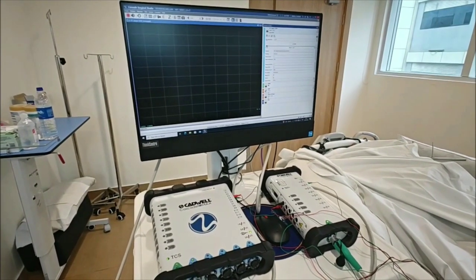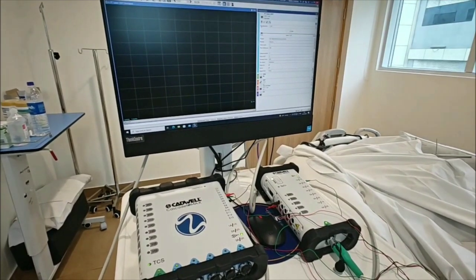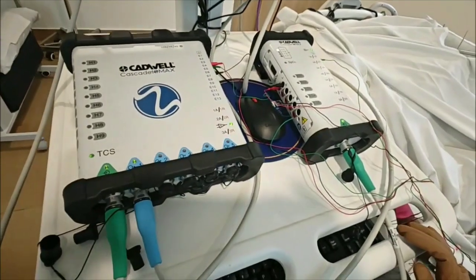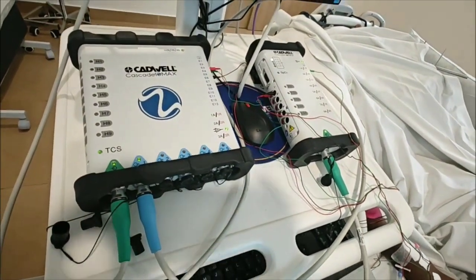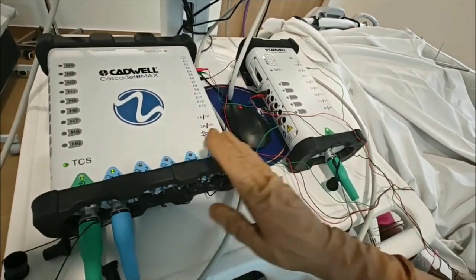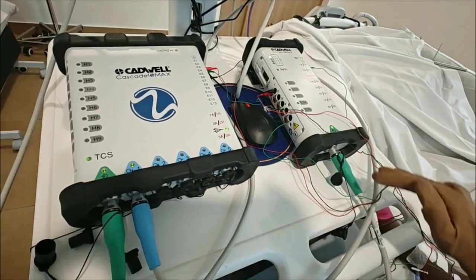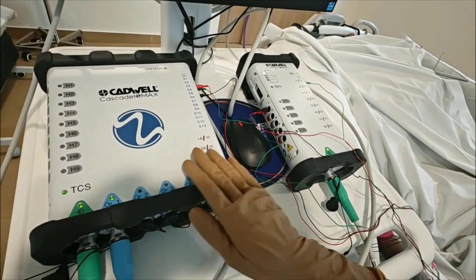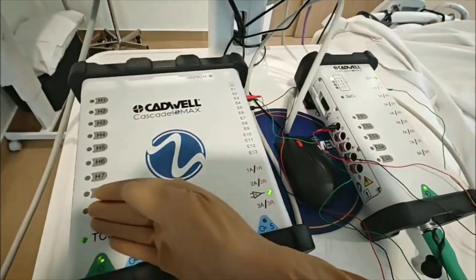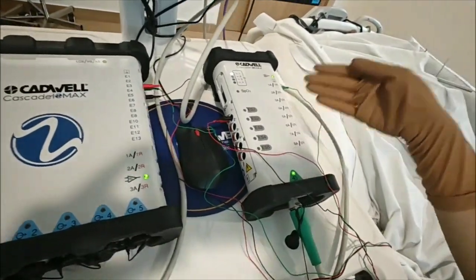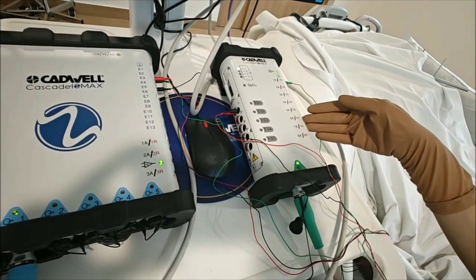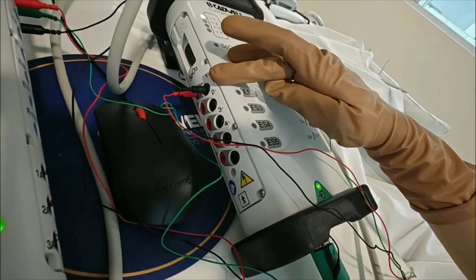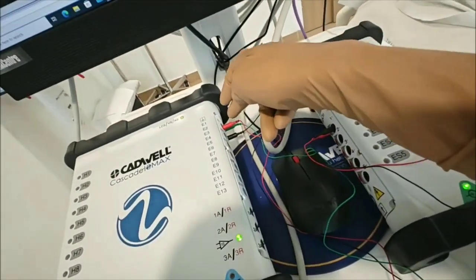The machine we're using here is the Cadwell Iomax system. To give a rough idea of how it works: it has two modules — a cortical module and a limb module — connected by a cable. It has a receiving area and a stimulating area. For SSEP, I've connected the stimulating electrodes on the stimulating side and the recording electrodes on the receiving side.